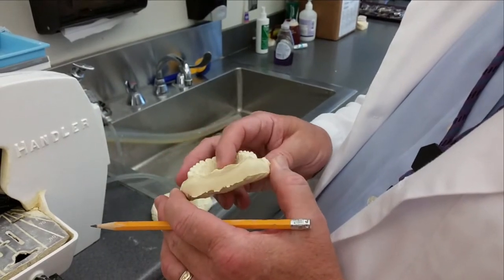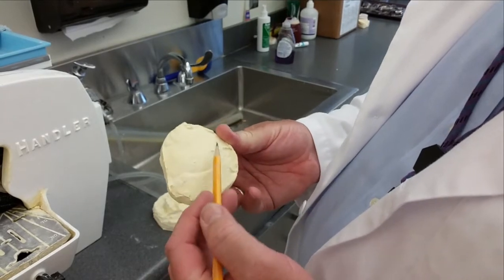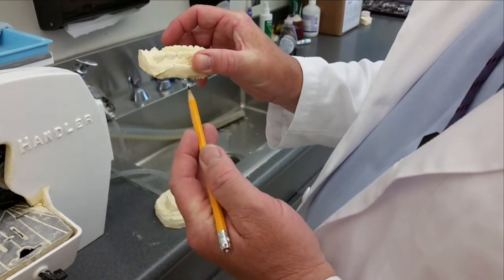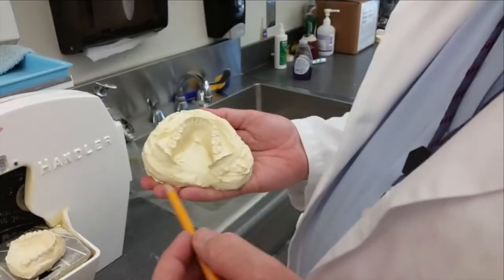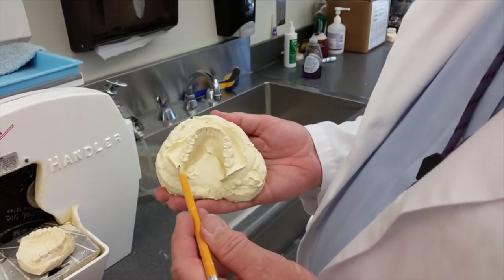You'll also notice that the base of the model is not flat, which would be preferred, so that will require some trimming now to make it so that the base is parallel or in the same plane as the occlusal table. On the lower model, you'll see now that we've also captured the retromolar pad area here and here.